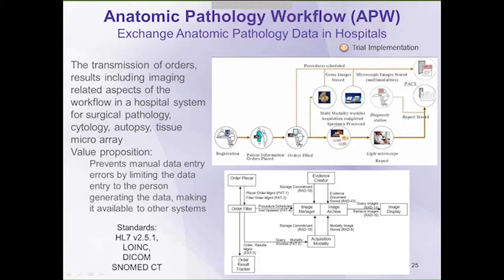The specialty of anatomic pathology is currently undergoing a transformation. I would say most facilities in the world today still leverage a microscope and glass slides, which look at tissue that's 5 microns thick and is viewed through optics in real time to render diagnoses. However, the future is a digital one in which those glass slides have been captured through those optics into a computer system, and then the pathologist or the interpreter of those images is actually sitting at a computer station looking at the image on a monitor.